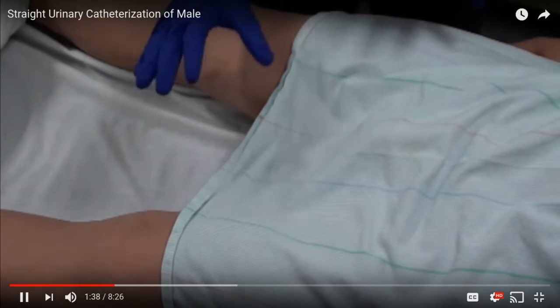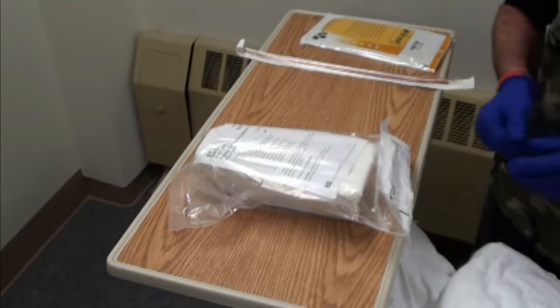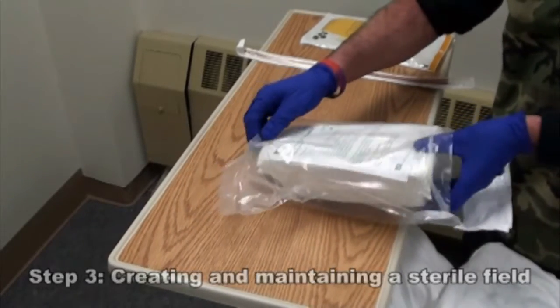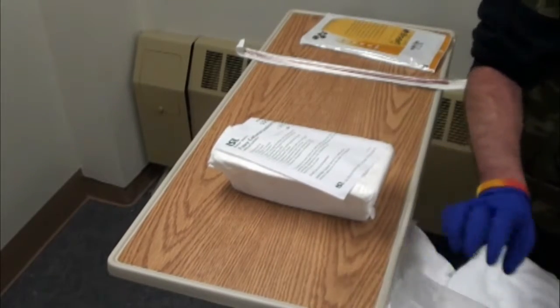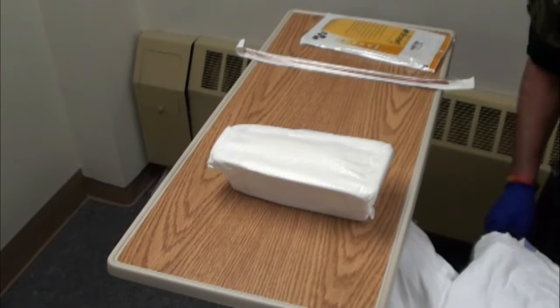Ask you to keep your legs spread just like that, the way you have them for me, okay? All right. Okay, I'm now going to open up my catheterization kit. Place that down there. Dispose of a piece of paper on top.